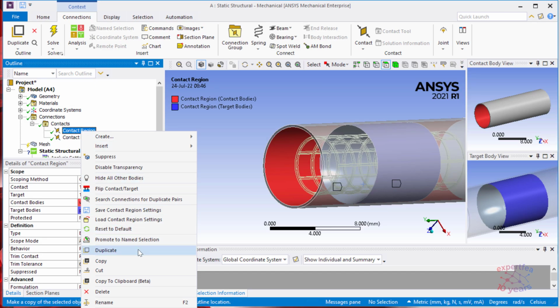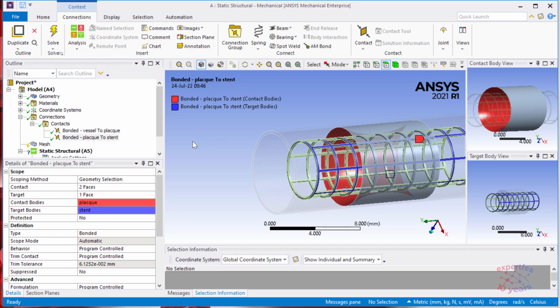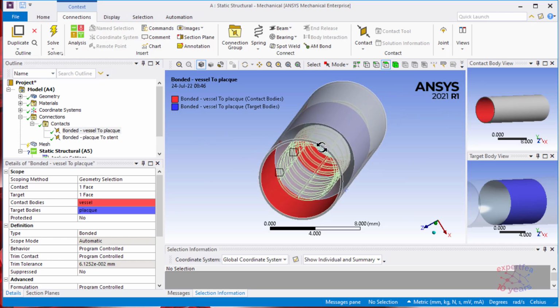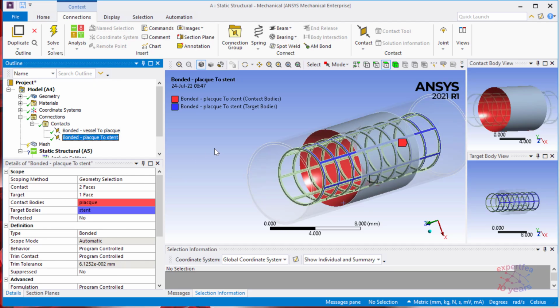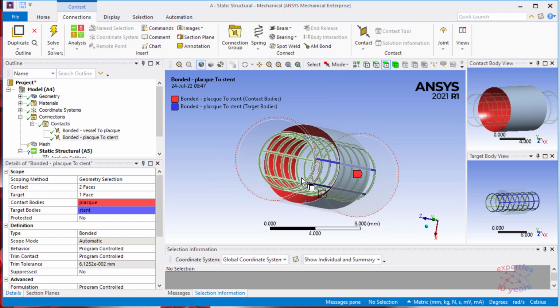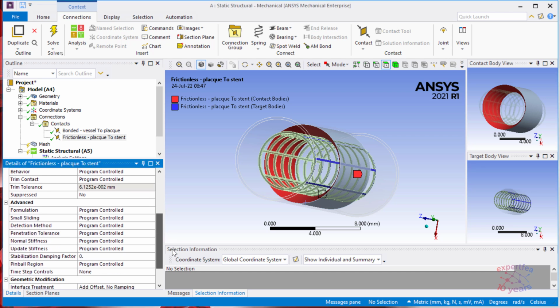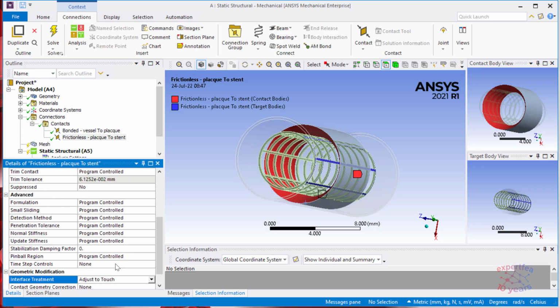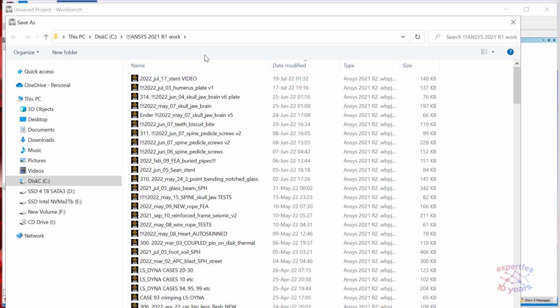We can right click each contact and choose rename based on definition. Regarding vessel to plaque, we have nothing to comment, we can leave it like that. But regarding plaque to stent, let's change its properties to, instead of bonded, to frictionless. And it's very easy if we choose just a touch. Everything should be taken care. Let's save this project.